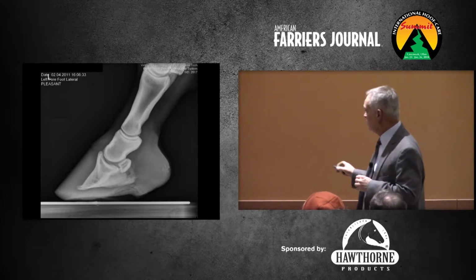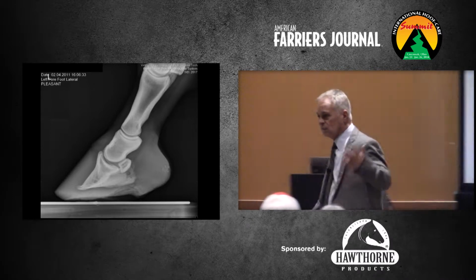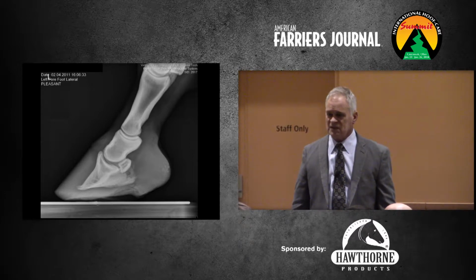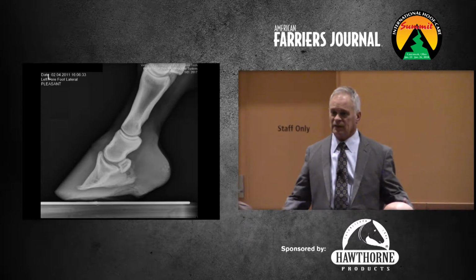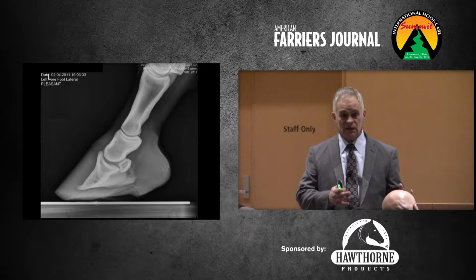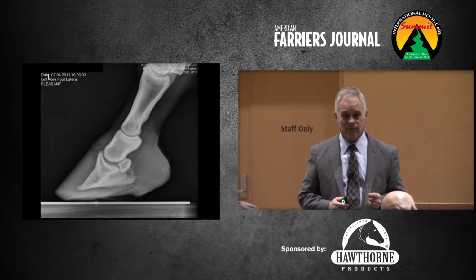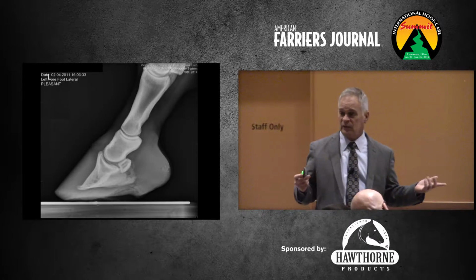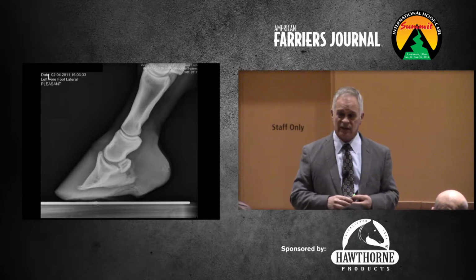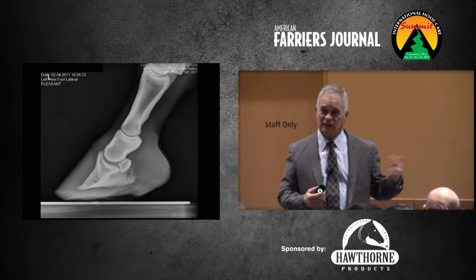Okay? And so what we would say is, if you have a horse like this, the farriers, man, you can't be this X-ray vision person and know all this stuff. You have every right to say, twice a year I need this horse radiographed to make sure we're going in the right direction. And the owners need to give you that. Okay? If you needed it 4 times a year, you do it. Okay, twice a year, if you're like, okay, I got this, then you might go to once a year. But what happens when you start feeling too good about it, it comes back to haunt you, in my experience.